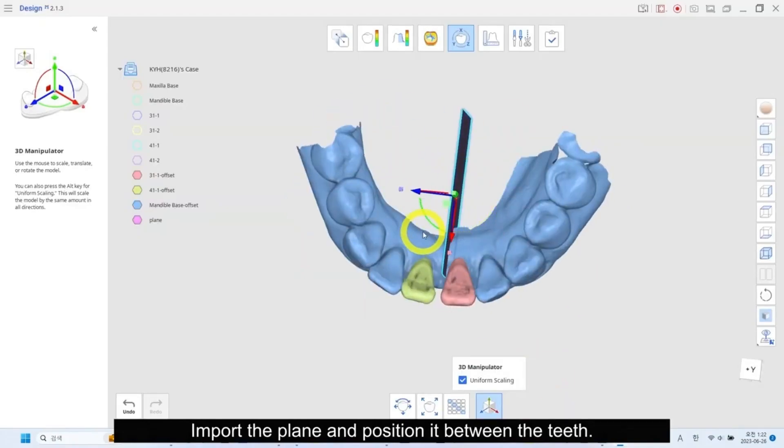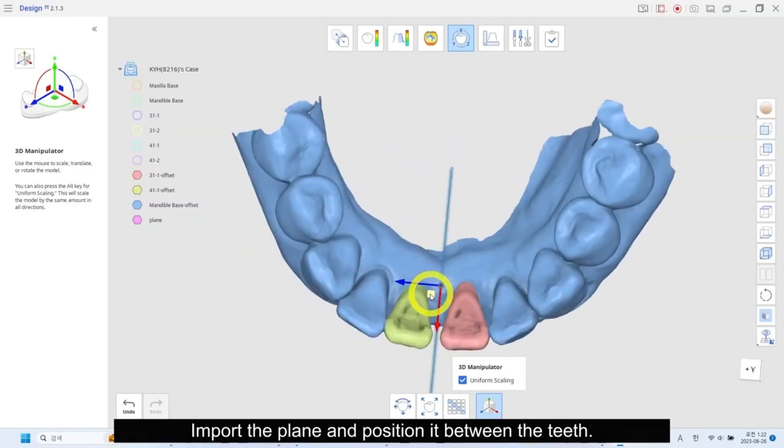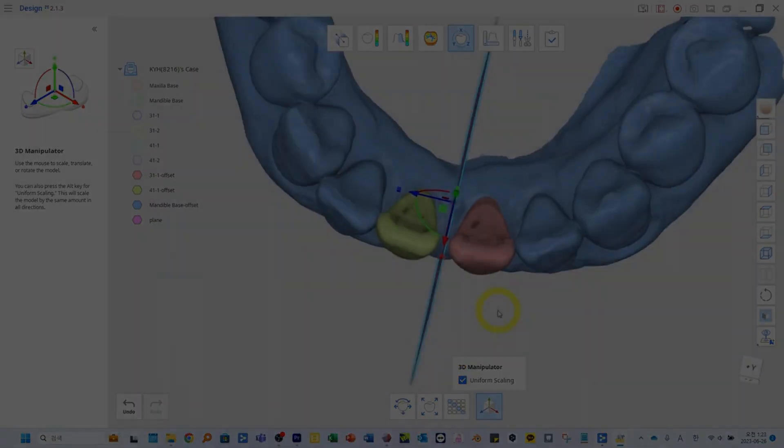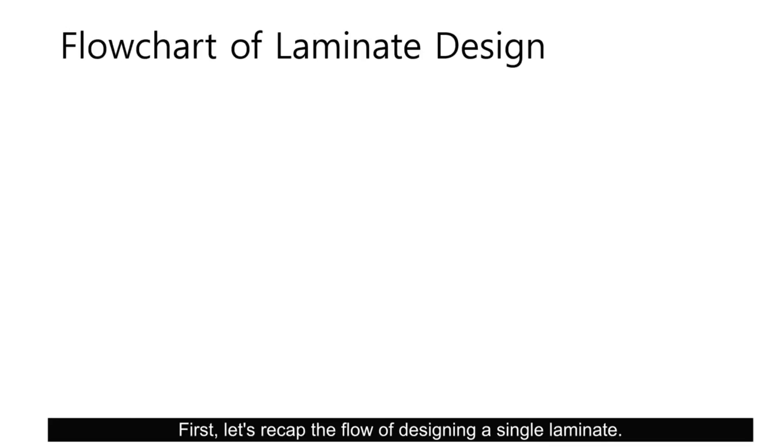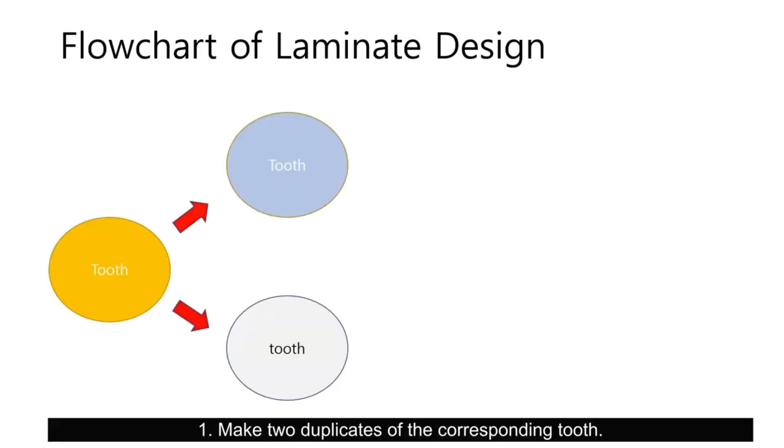Import the plane and position between the teeth. First, let's recap the flow of designing a single laminate. Make two duplicates of the corresponding tools.